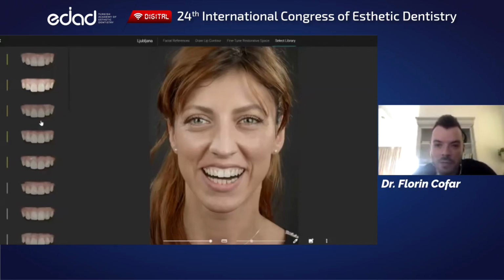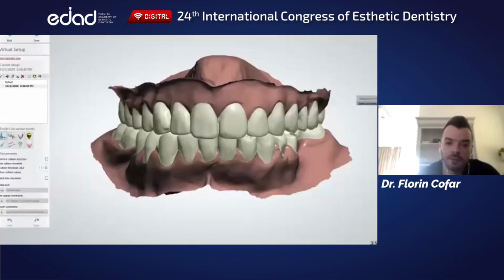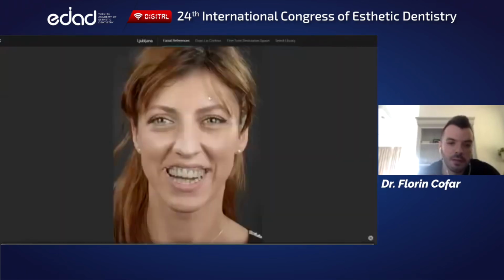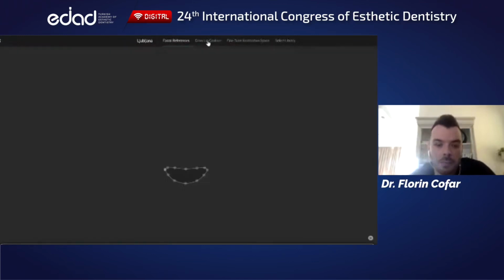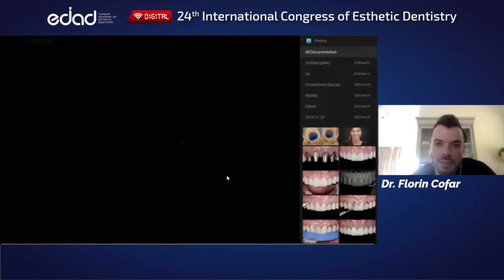So here you can see we use things like facial recognition, artificial intelligence, and algorithms to do things like, first of all, detecting the face. We are auto aligning it. Of course, you can modify that if you want. Let me just go like this. So you can just modify if you want. Then the lip, play the, oops. So the face is detected automatically.